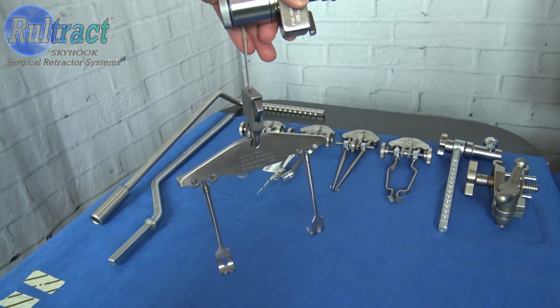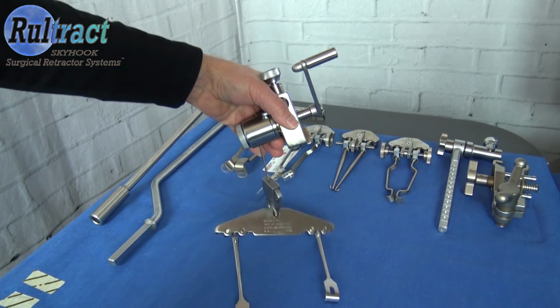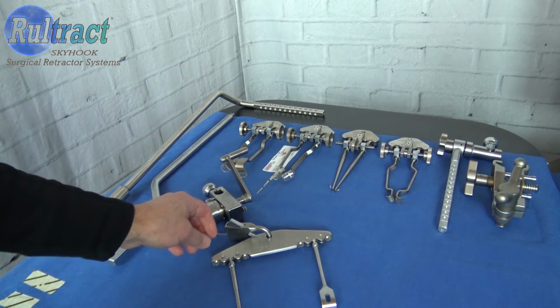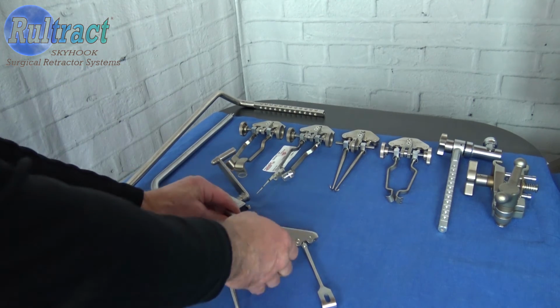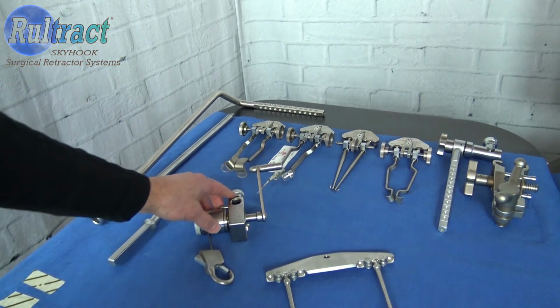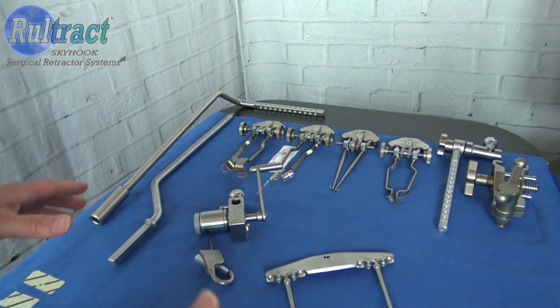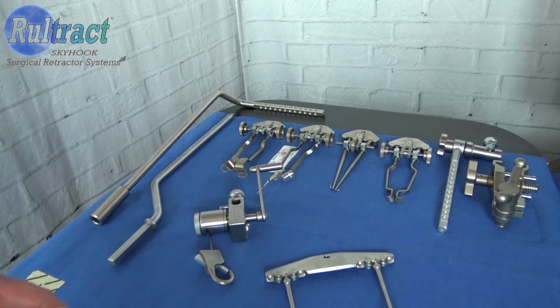And I like to leave about 2.5 to 3 inches of cable exposed. Then I remove the rake plate, because the surgeon doesn't always want to have this rake plate on when the retractor is put into place in the OR. So now your Rultract ratchet, rake assembly, and retractor set is ready for sterilization and use.